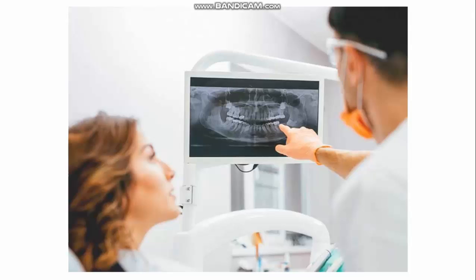This examination may disclose dental problems that will prove crucial to decisions relevant to the radiographic examination. Radiographic examination is necessary when the history and clinical examination have not provided enough information to evaluate completely a patient's condition and formulate an appropriate treatment plan. Radiographic exposures are necessary only when the patient will potentially benefit by the discovery of clinically useful information on the radiograph.